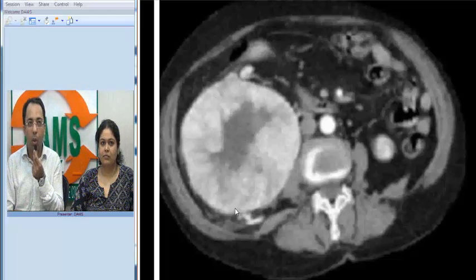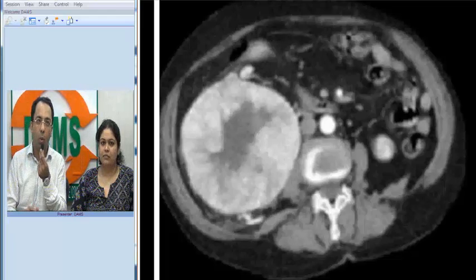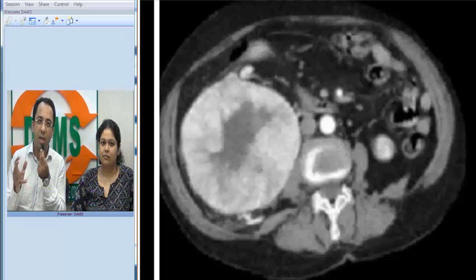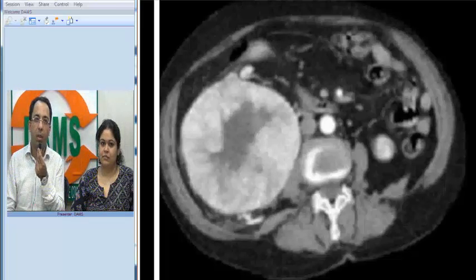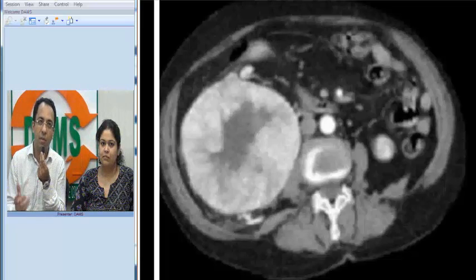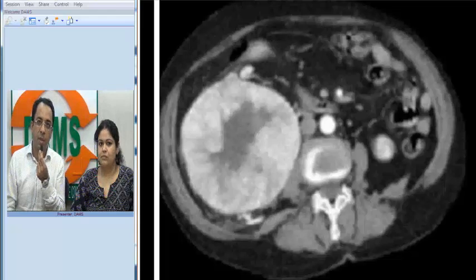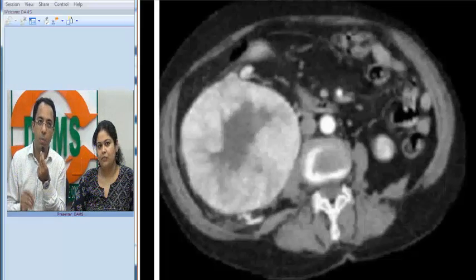A renal origin lesion enhancing with a central scar — the differential diagnosis would include oncocytoma. However, as radiologists we cannot say for sure, because the central scar is characteristic of oncocytoma but is present in only one third of patients. Furthermore, RCC can also have a scar, so we cannot conclude clearly from imaging alone. When evaluating a possible oncocytoma, always look for multicentric lesions and concurrent RCC, which is possible in such patients.